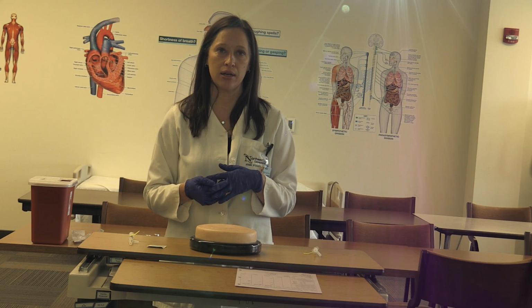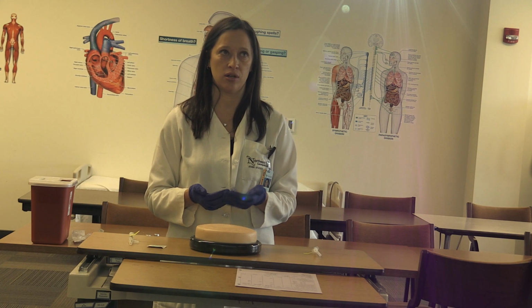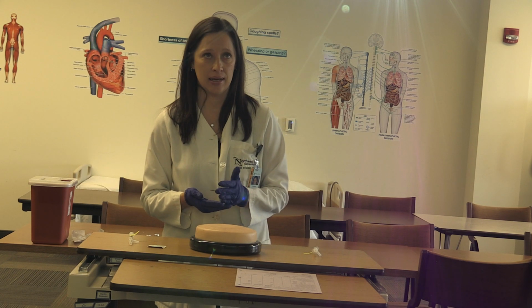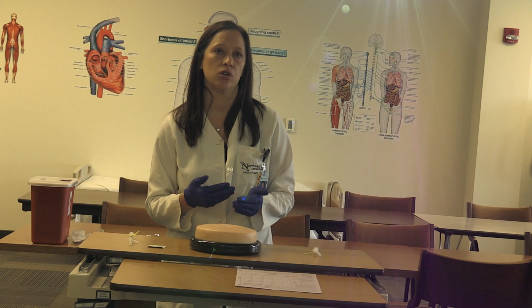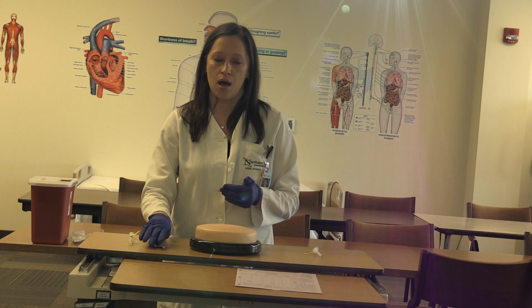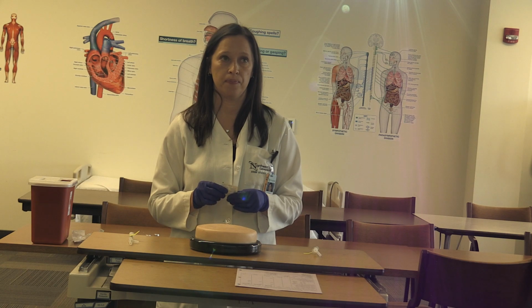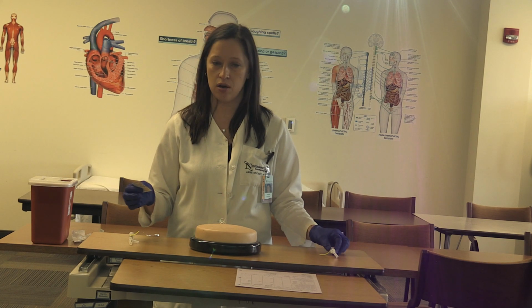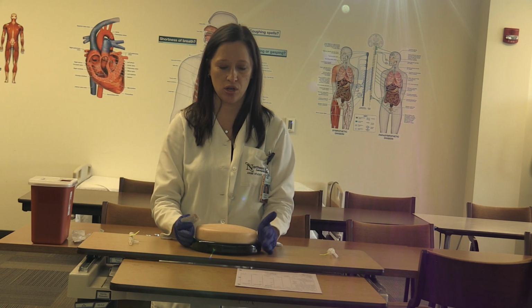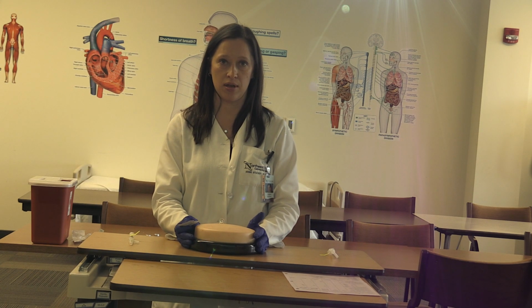So you want to raise the bed to a working height. You want to try to provide as much privacy as you can for your patient. Cover them with a sheet. Like I said, select an appropriate site where there's no bruising, edema, hardness, or inflammation. We give both IM medications via the Z-Track method. So now that I've done all of my checks, confirmed it with my patient, I'm going to show you how to give an IM injection with a Z-Track method.